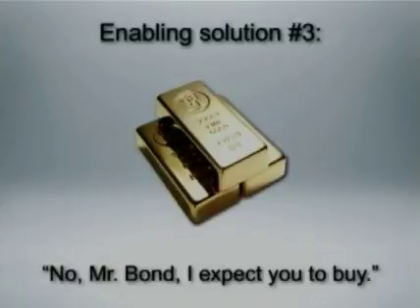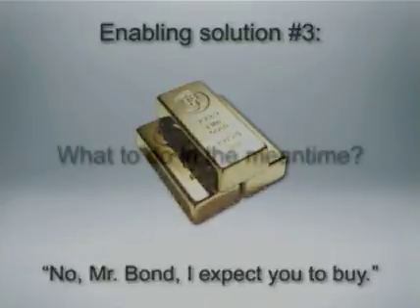And really the only solution to this is going to be acquiring additional equipment that can do 3D with the solid state matrix array transducers, and that eventually will happen. We're not there yet. Like many labs, we have a refresh cycle that runs every few years, so we may upgrade a machine or two every few years, but eventually we will get there. So what do you do in the meantime?